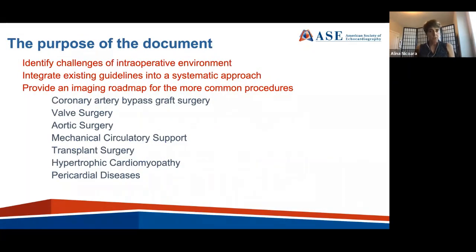So what is the purpose, what was the rationale behind this document? Transesophageal echocardiography has grown and matured as a sophisticated imaging tool at the same time with numerous developments in cardiac surgery. Cardiac surgery is now minimally invasive or hybrid. There has been an explosion of mechanical circulatory support, and we are taking care of more and more complex patients. All these changes have led to the increased integration of TEE in the care of the cardiac surgery patient, be it for optimization of pre-surgical planning, hemodynamic management, or post-surgical assessment.